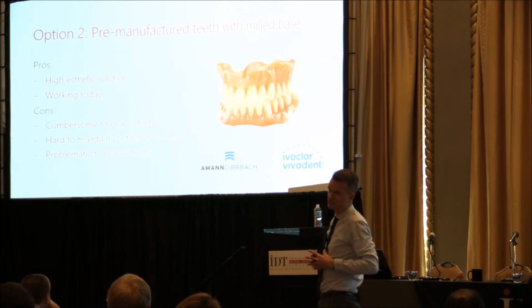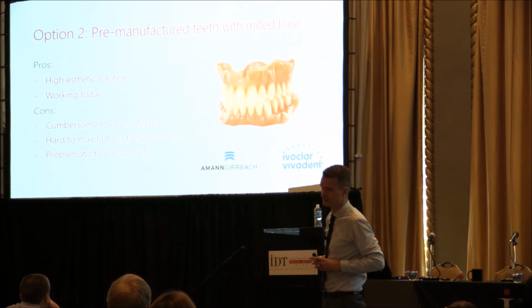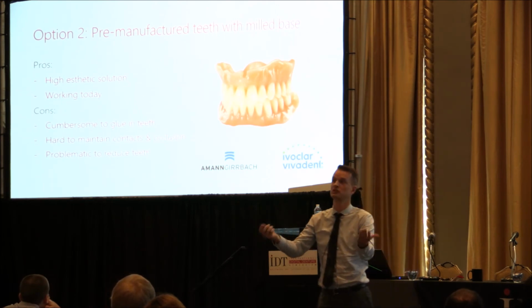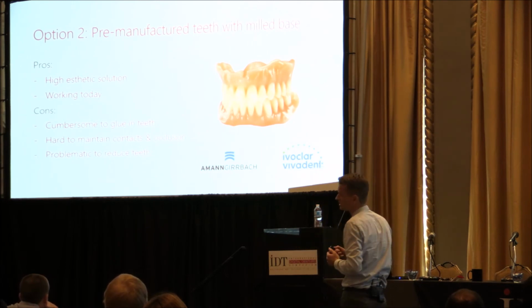So do I like denture teeth from a digital point of view? My feelings are mixed. And why are my feelings mixed about denture teeth? I mean, they are highly aesthetic. They are working today. They are cheap, or less expensive at least. So that's good. They are cumbersome to glue in.